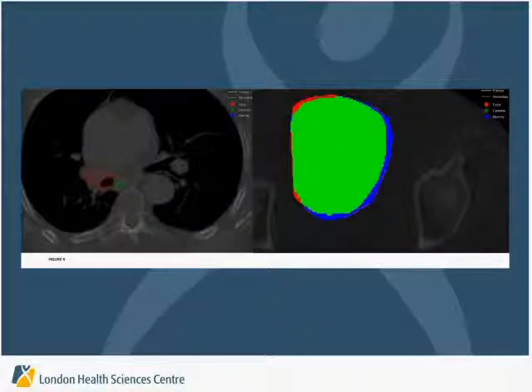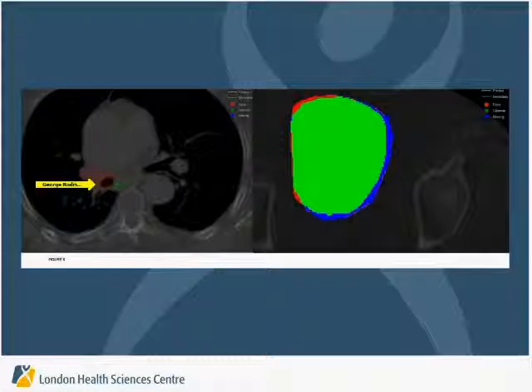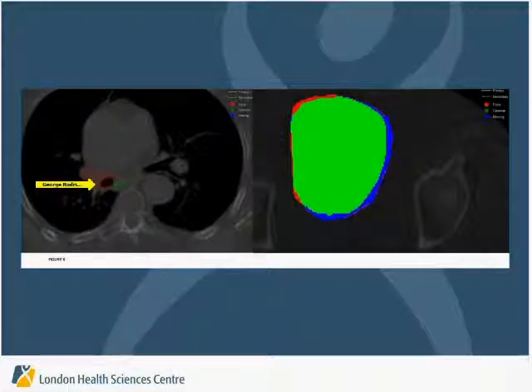Here is the example of the under-contoured bladder that the system was able to detect, and this is an example of an over-contoured nodal contour that the QA2 system picked up. Thank you.